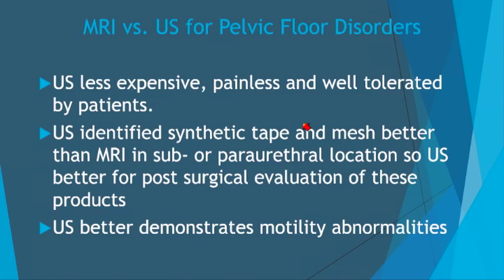Well, finally, I'd like to discuss the role of MR versus ultrasound in pelvic floor disorders. All of us know that ultrasound is less expensive, painless, and very well tolerated. I mean, we don't have to worry about patients having claustrophobia. And ultrasound, furthermore, is excellent in identifying synthetic materials, much better than MR. MR studies which have been done in vivo show that these materials are very difficult to identify.